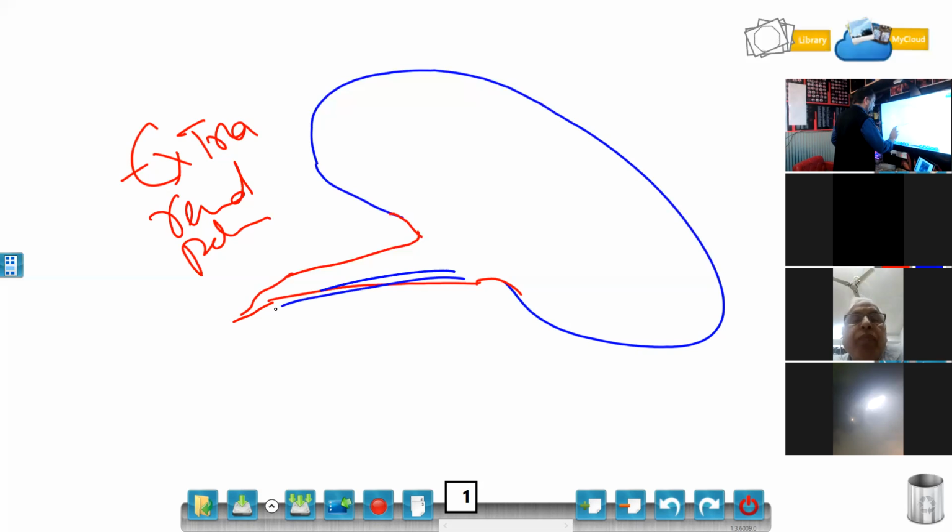And if you don't know that this is an extrarenal pelvis, you will easily label this as hydroureter with a query calculus, because you are scanning here and there, you are not getting a calculus, and you will never get a calculus because this is not due to obstruction. The ureter is not actually dilated. This is the pelvis, which is not inside the kidney but outside the kidney.